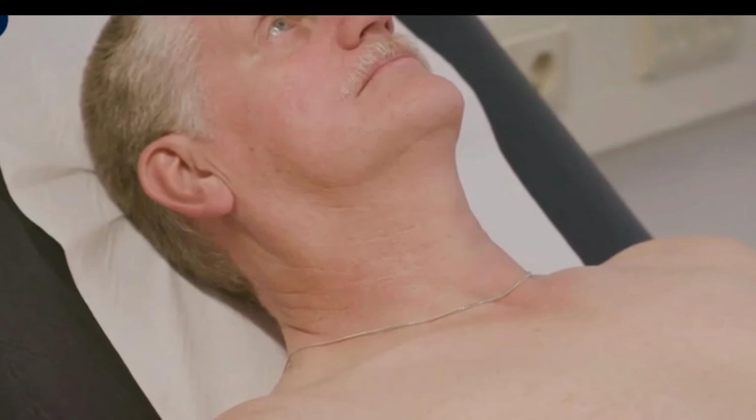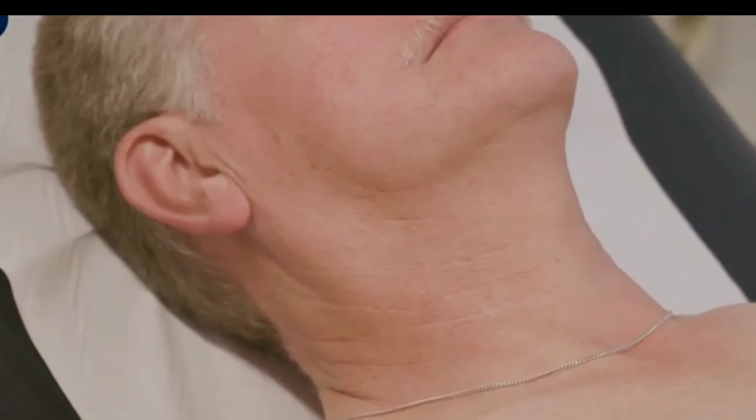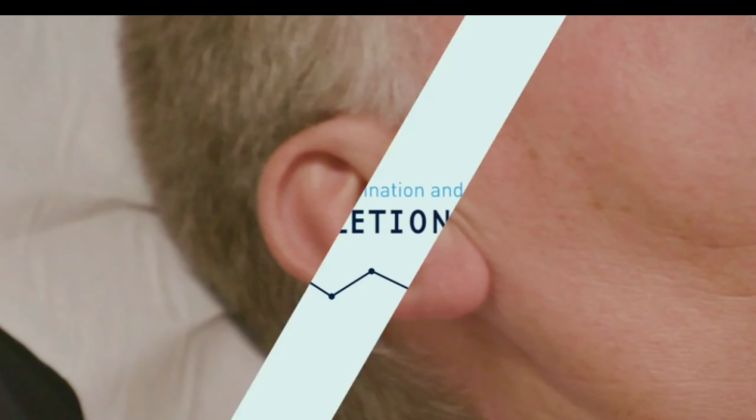The patient's body temperature is also measured, normally using a tympanic thermometer. However, the exact method of use will depend on the type and brand of the thermometer used.